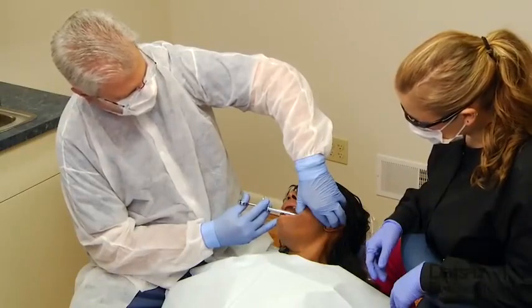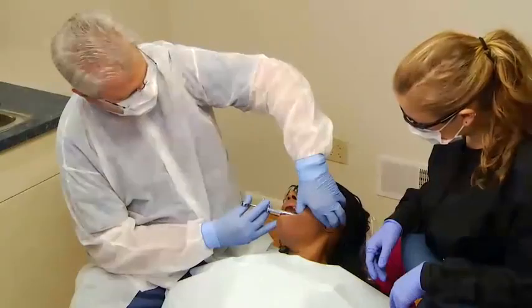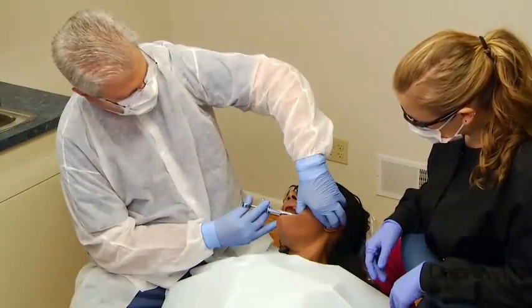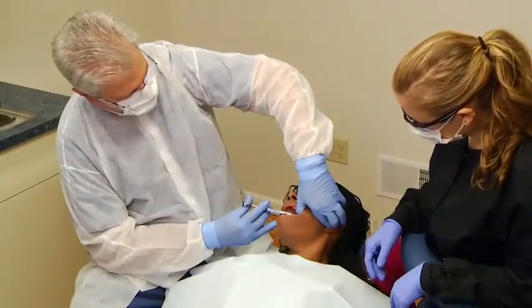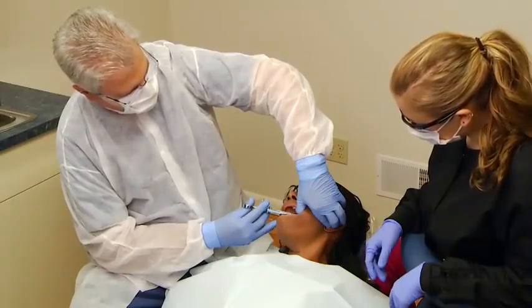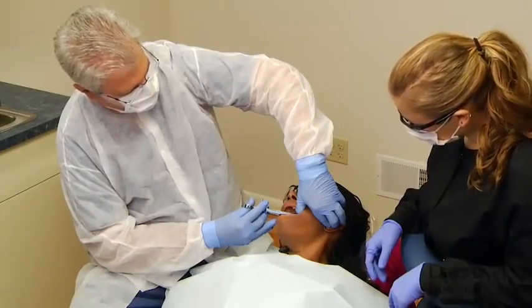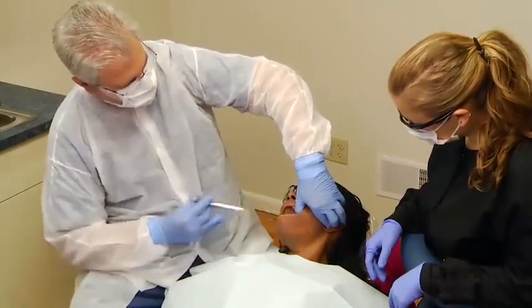The patient is then cautioned to keep the mouth open for 30 seconds after the needle is withdrawn. This maneuver is thought to help spread the anesthetic solution and minimize the distance from the injection site to the nerves of interest. Typically, anesthesia occurs within 5 minutes after injection.